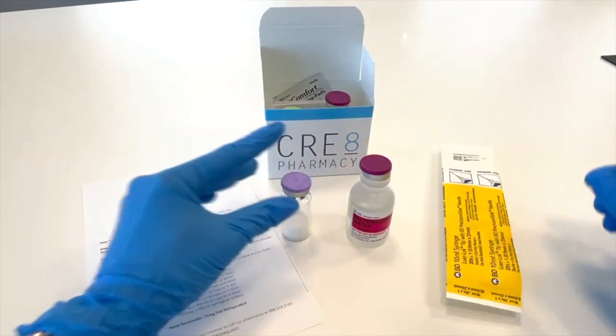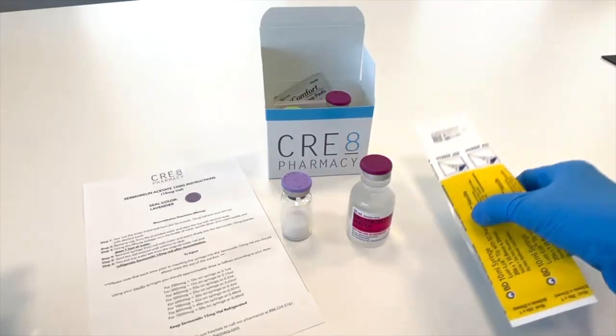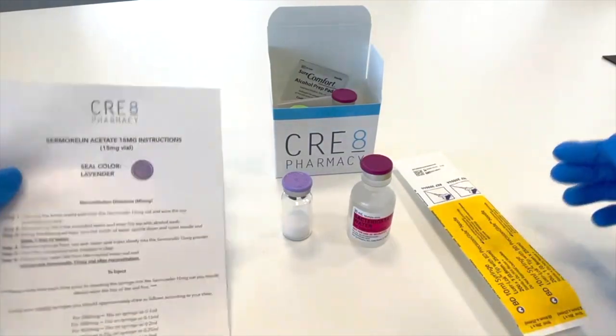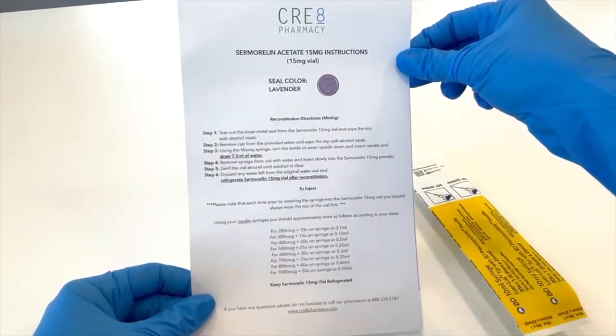Also included will be a mixing syringe that can be used to mix, and also two alcohol swabs that can be used to clean the top of both vials. Lastly, you will find detailed mixing instructions with each medication.